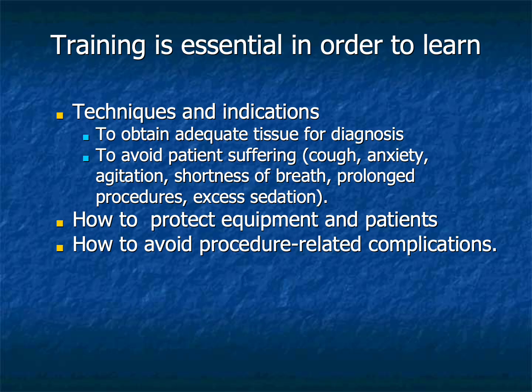Transbronchial lung biopsy is a procedure that requires dedicated training. The objective is not simply to obtain tissue. The objective is to obtain adequate tissue safely while minimizing patient discomfort and avoiding unnecessary complications. Proper training improves diagnostic yield while reducing cough, anxiety, prolonged procedures, excessive sedation, bleeding, pneumothorax, and equipment damage. Competency, therefore, benefits both patients and operators.